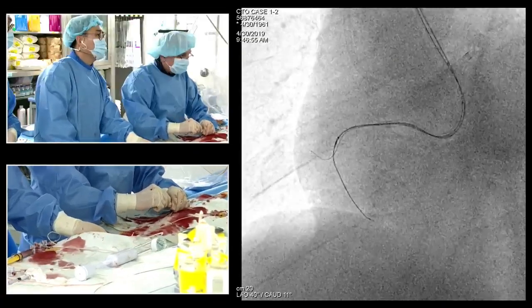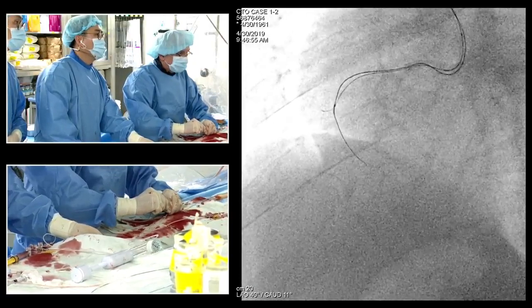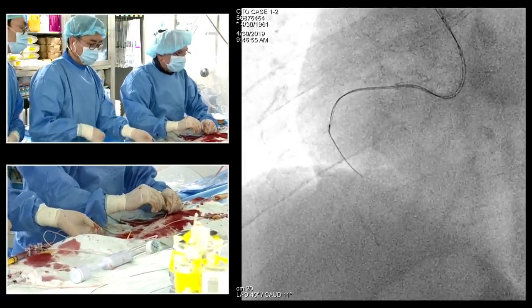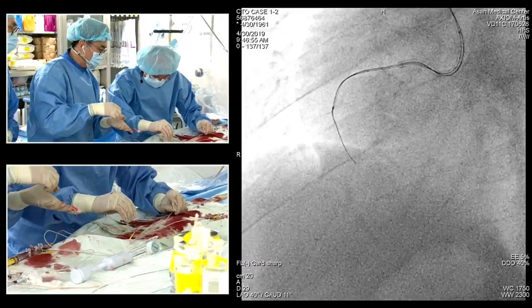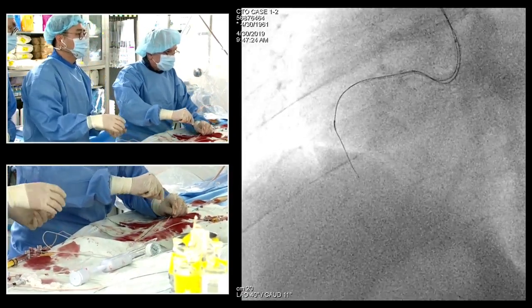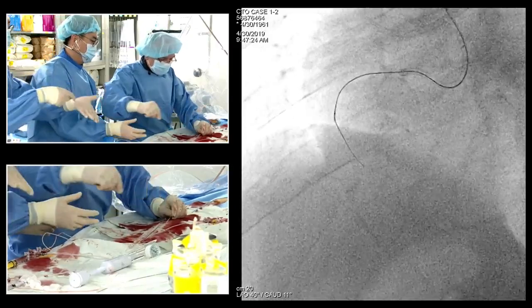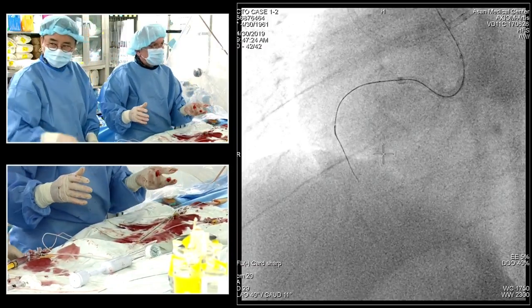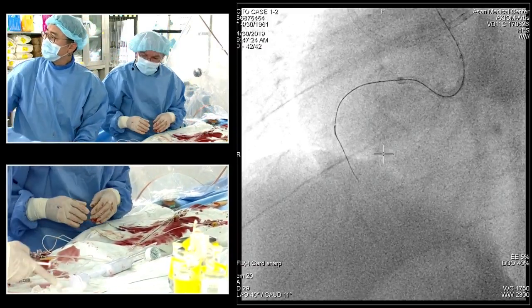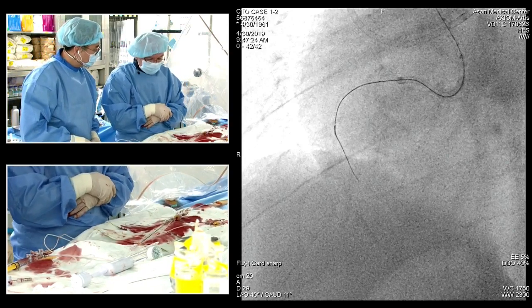Yes, I agree, but I have very good experience with the combination of this. Let's remove, actually, the XT. XT, yeah. Okay. Your arguments are all correct, yes, but I'm not so familiar, especially in smaller persons, with 8 French guides. Conquest 12, please. 12? 12.